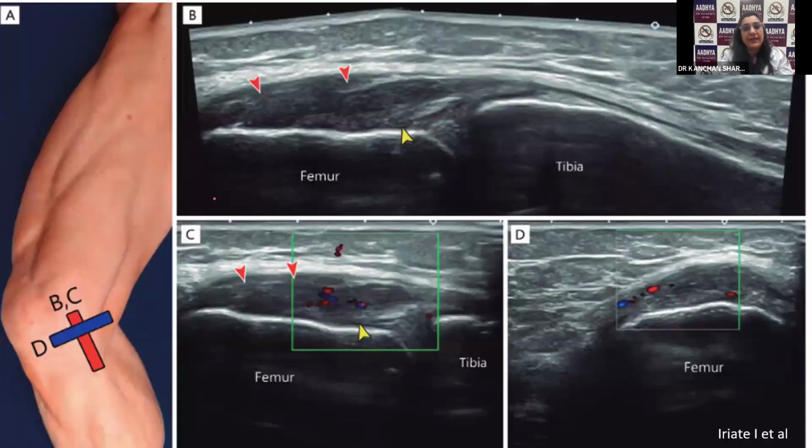Then on the medial knee, yes, we have seen the superficial layer of the ligament. So ligaments, you can have a sprain, you can have a tear, you can have a complete rupture of the ligament, okay? So again, go back to how I have shown you the short axis, okay?